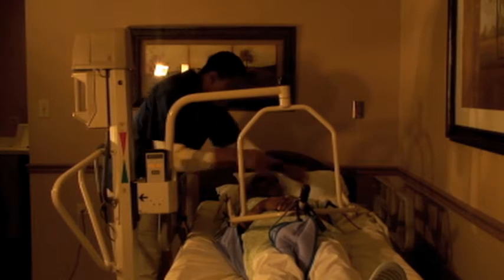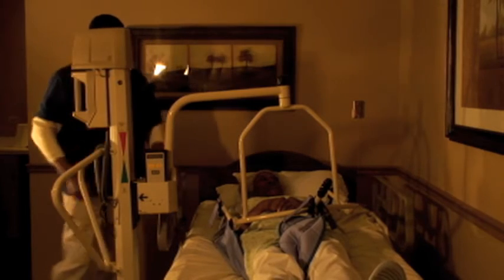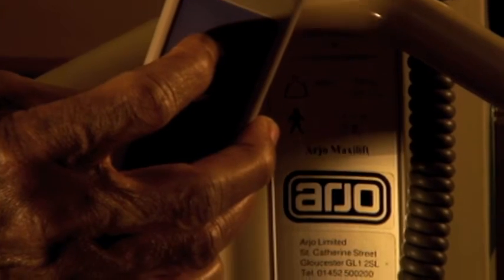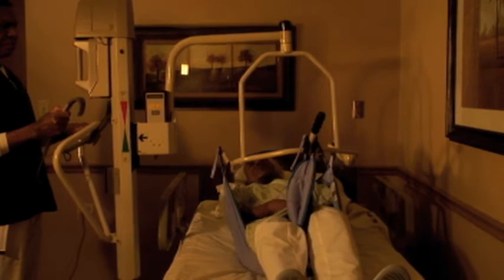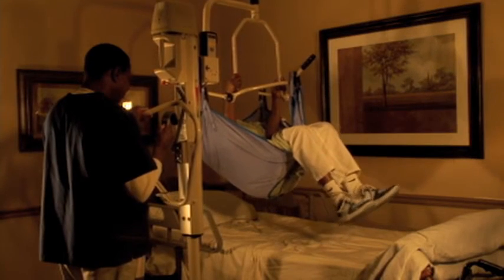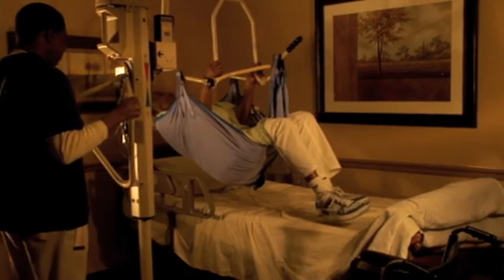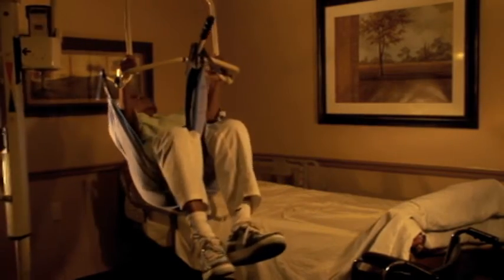Finally, attach the loops on the sling to the corresponding hooks on the end of the boom. Use the button located on the control box to raise the boom. Slowly lift the resident off the bed. The design of the lift will raise the shoulders first and then the rear end. The resident can grab the crossbar of the cradle for added stability. Once the resident is in a comfortable seated position, they can be moved to their new location.